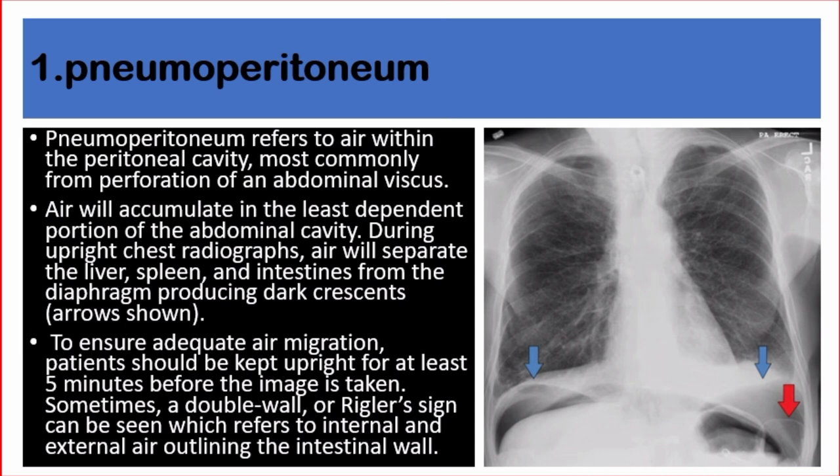To ensure adequate air migration, patients should be kept upright for at least five minutes before the image is taken. Sometimes a double wall or Rigler sign can be seen, which refers to internal and external air both outlining the intestinal wall.